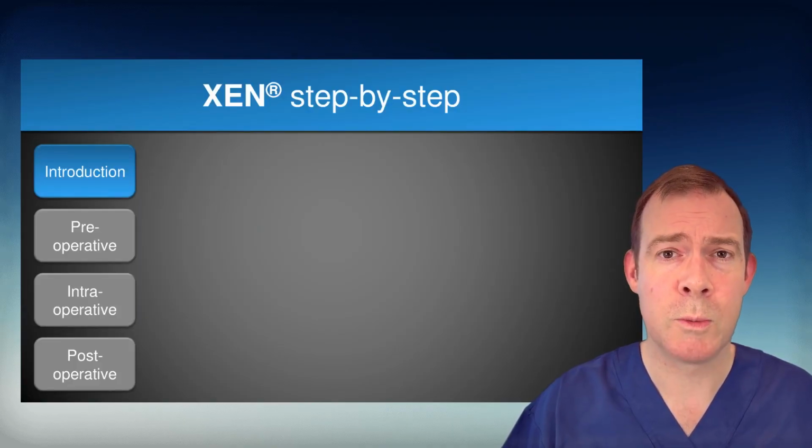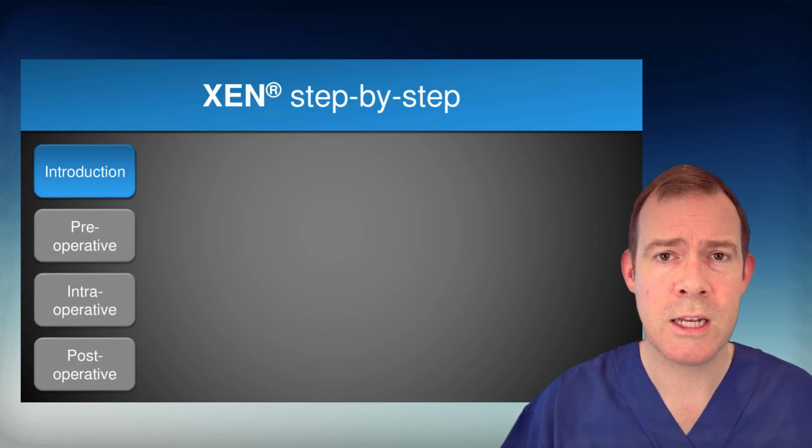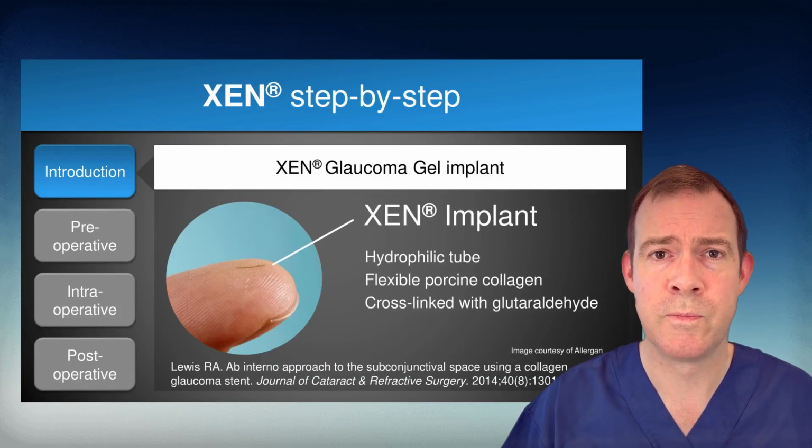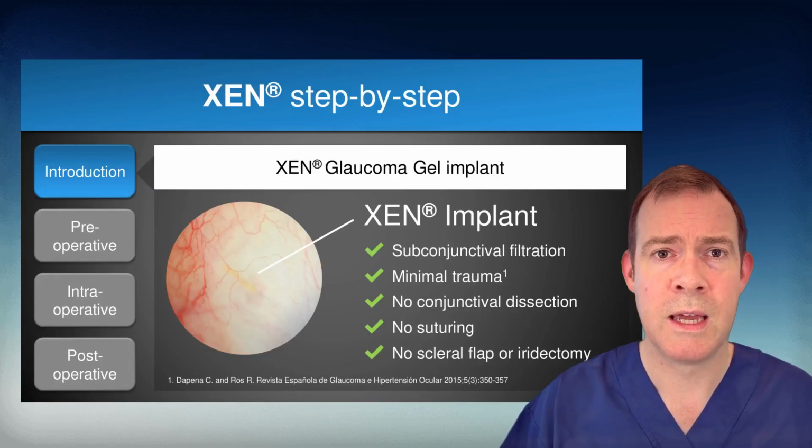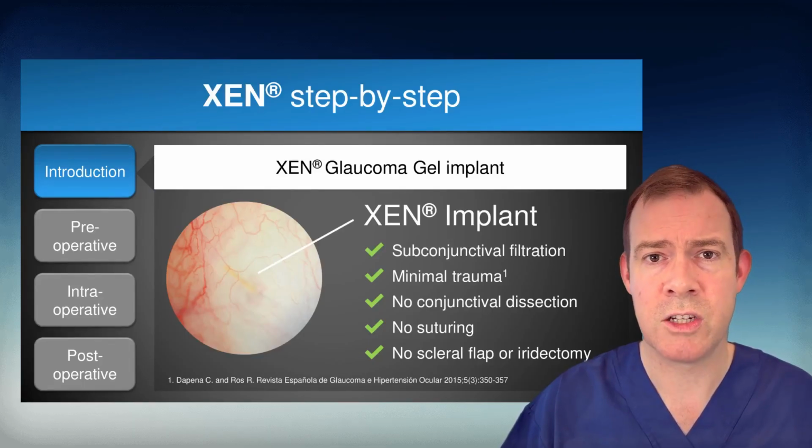In this module, we'll be looking at the pre-operative, intraoperative, and post-operative steps of successful ab interno XEN insertion. The XEN is a hydrophilic tube made of flexible porcine collagen, which has been cross-linked with glutaraldehyde to prevent degradation. It's the only minimally invasive subconjunctival surgery that can be inserted ab interno, and this gives it some unique advantages.